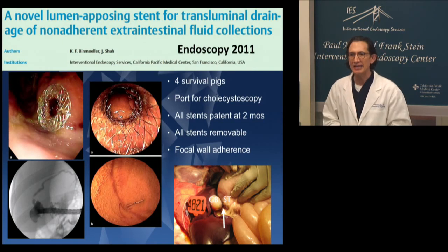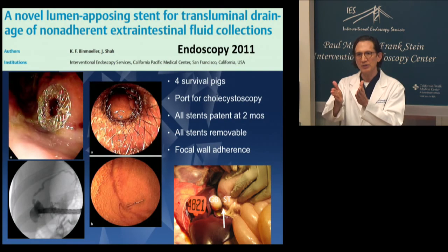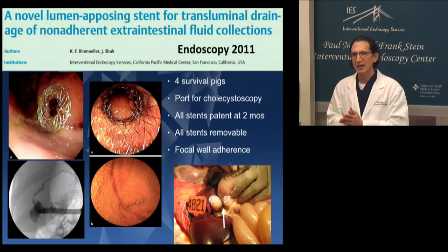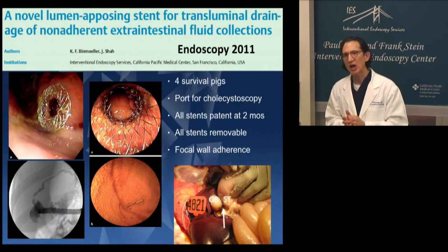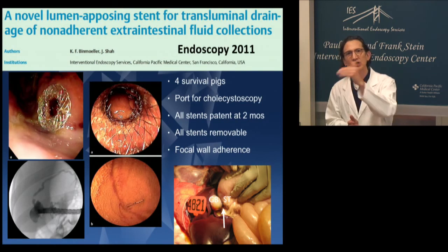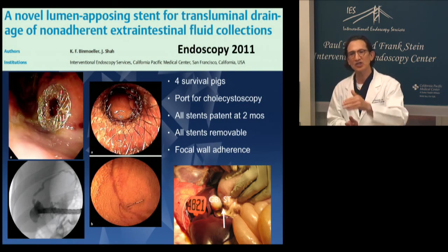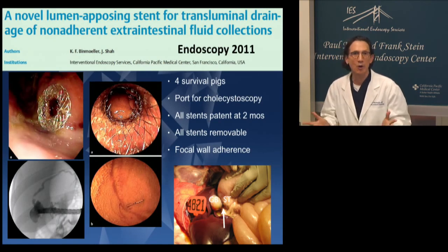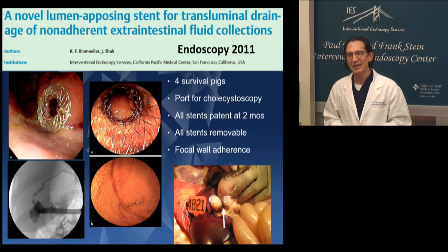You can see that on the bottom right, the gallbladder and the bowel wall. This is not duodenum, it's actually stomach because of the anatomy of the pig. And you can see the stent. All right, so on the images on the left, you can see the scope going through the axial stent into the gallbladder. We inject contrast, and you can see it now antegradely. This is an antegrade injection into the bile duct via the cystic duct. And there on the right lower image, you can see the view of the normal gallbladder. And for me, that was amazing to actually see what the gallbladder looked like on the inside. I'd never seen that. Next slide.